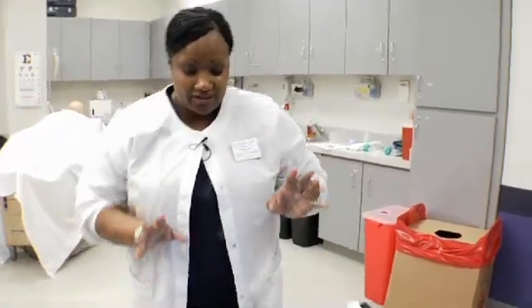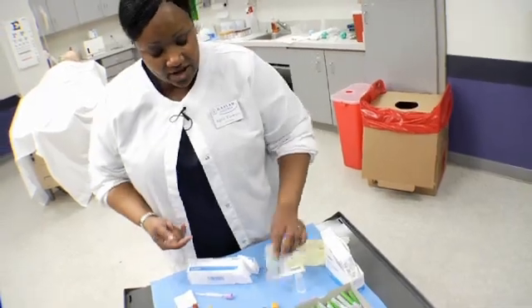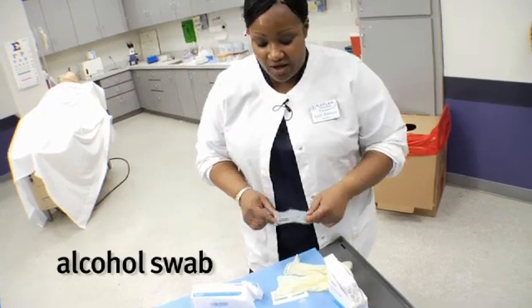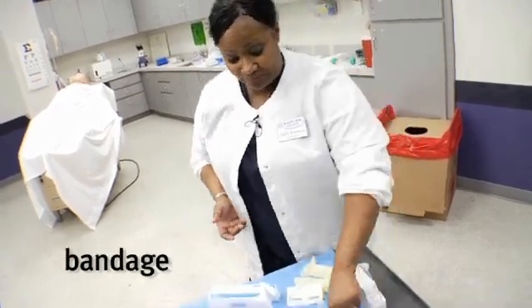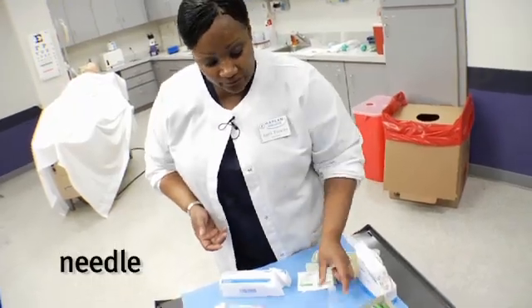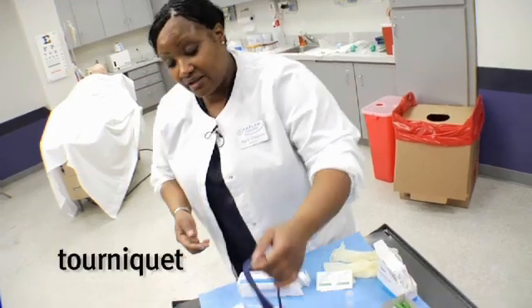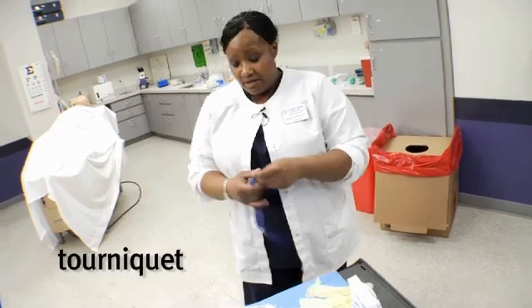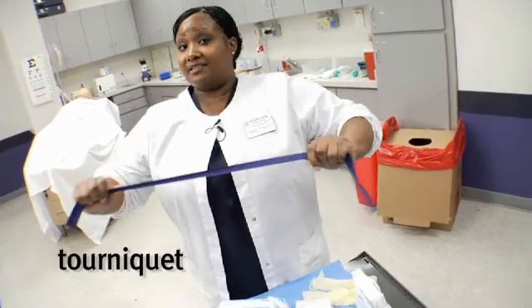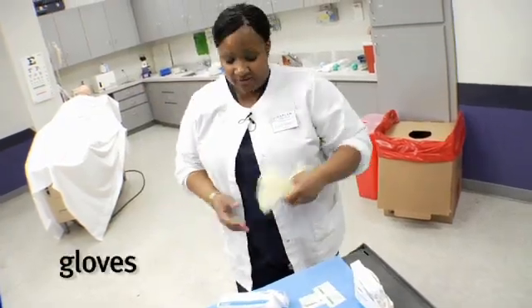Then we're going to need the gauze pad. Here are your individually wrapped alcohol swabs, a band-aid just in case the patient needs one, your needle, the actual needle holder, and your tourniquet. Always be sure to ask the patient if they have a latex allergy because we have these tourniquets in non-latex as well. And that actually goes for the gloves too.